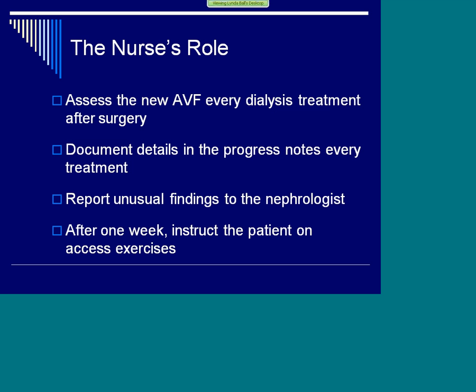So what is the nurse's role? Well, you need to assess that new access every dialysis treatment after they have their surgery, and you need to document that in the progress note every treatment. It's not appropriate to talk about the patient in the break room and say, well, it doesn't feel very good, or, well, I don't know, I didn't check it. We need to be documenting this. This is really, really important. Remember, this is going to be their new lifeline.